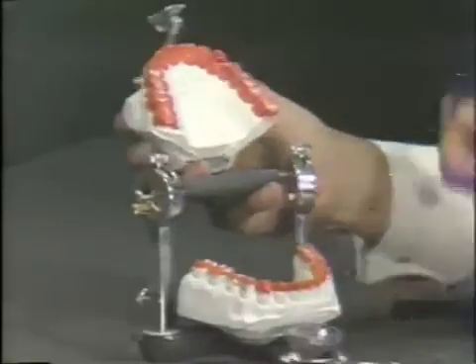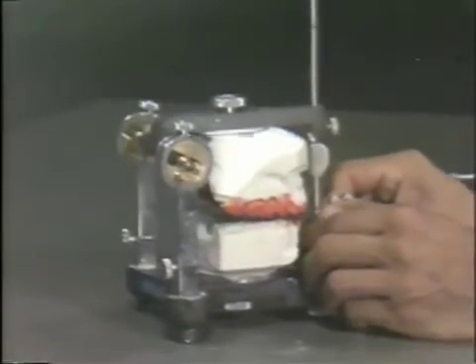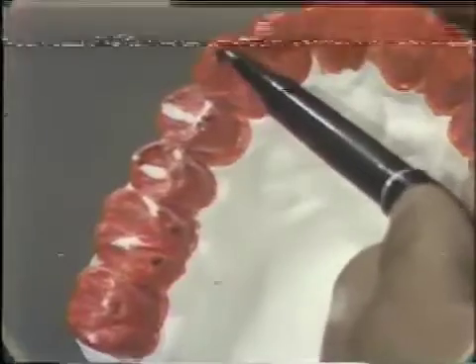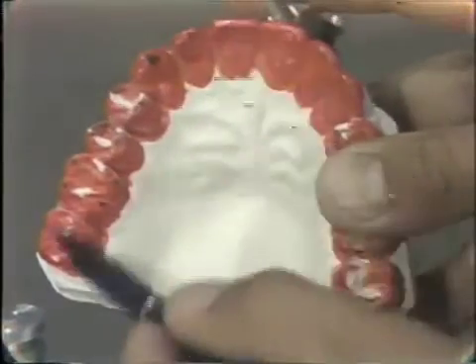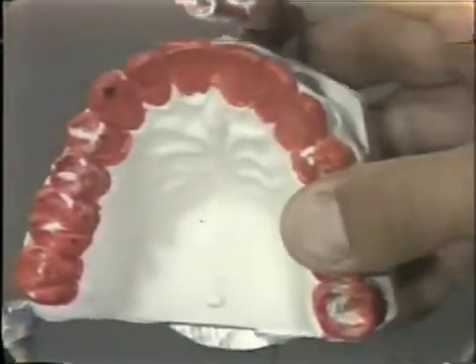Now I'm going to change the color of the ribbon here and go to the black to check this out, as I'm having some difficulty seeing the red on the upper teeth. Now if we look up at the maxillary again, we see that we do have some contact here on this cuspid, some contact here on this first bi, some contact here on the second bi, and some contact here on the first molar. This would not be called a group function — group function would be from the central incisor all the way around. This would be a multiple contact guidance in the working excursion, which is also perfectly acceptable because the load is shared.